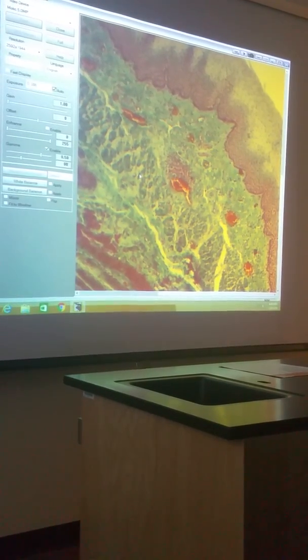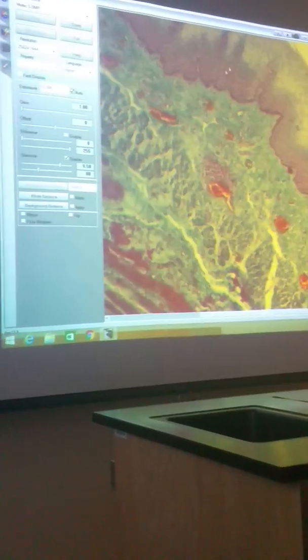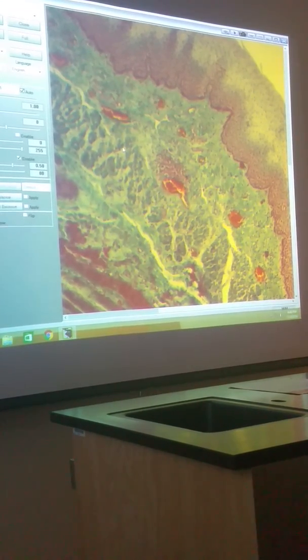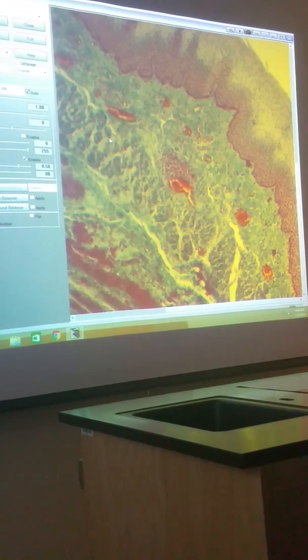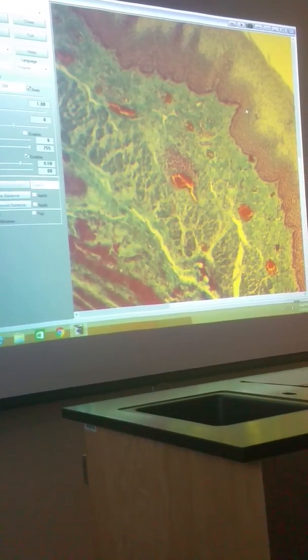If you ask what region that is, it's still mucosa, because this all makes up part of the whole mucosa. So I could still say region for this one, and it would be mucosa. Or I could even say layer on this one. It's the same thing.